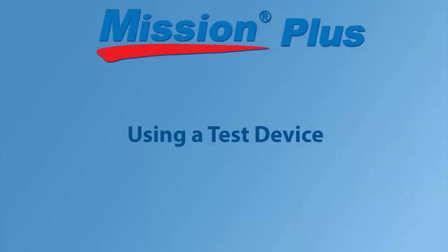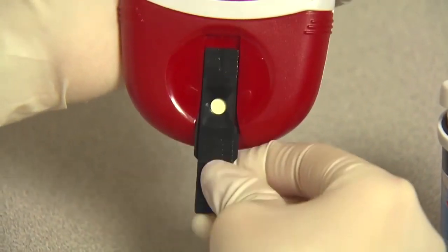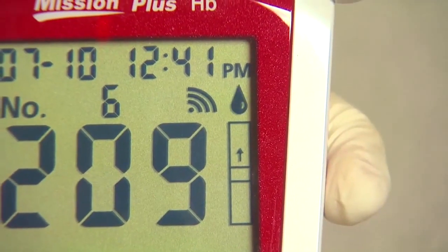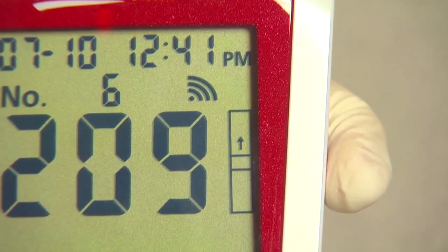Using a test device. Firmly insert the test device into the device's channel in the same direction as the arrows indicate on the device. Ensure that the test device is inserted all the way to the end of the channel until the position arrows are parallel with the 2 arrows on the device holder. The blood drop symbol will flash when the meter is ready for the specimen to be applied.